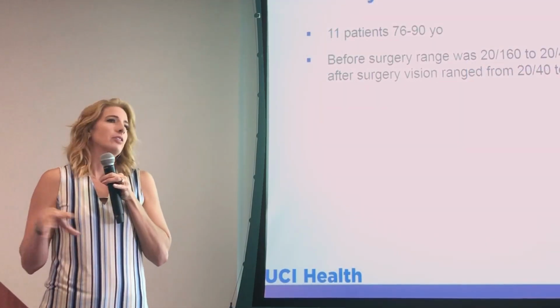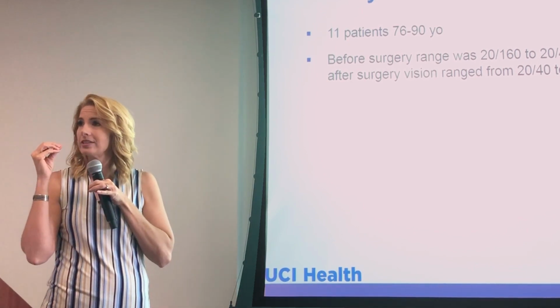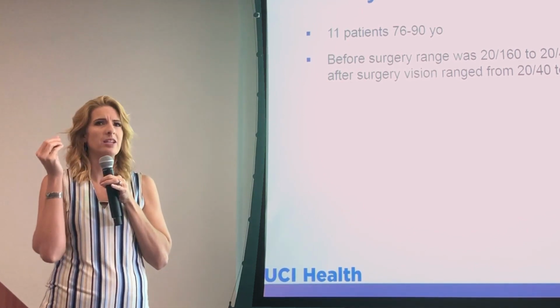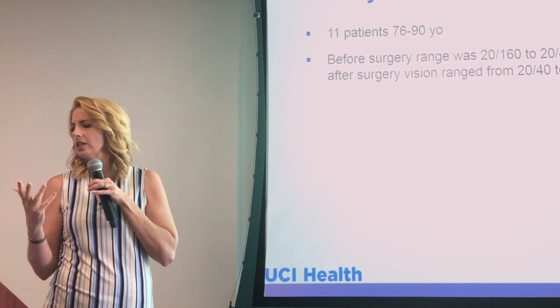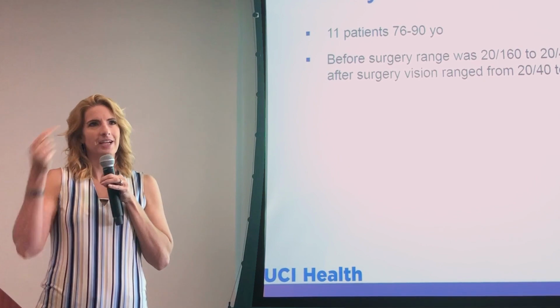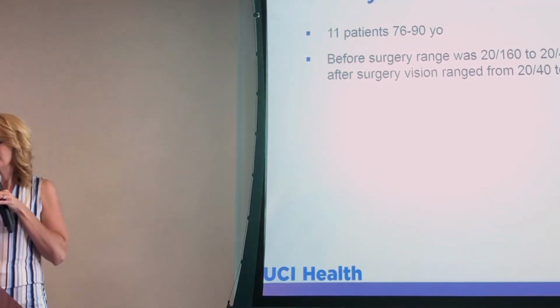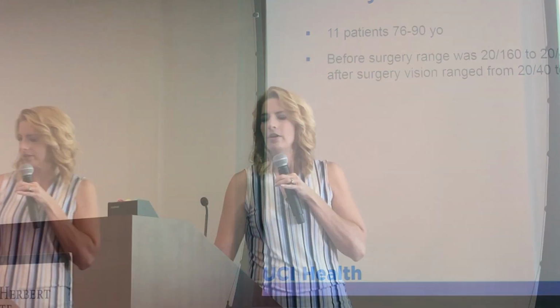Low vision devices are not usually covered by insurance, but with the implant, it is covered by insurance, most of it anyway, in a big way, and so is the rehabilitation. So here you have a process where instead of having to grab your magnifiers, it's actually inside your eye, and it's been paid for in the system, which is an amazing thing. But does it really work? Four patients out of those 11 achieved four times improvement. Now here's the crazy thing: the telescope only does three times improvement.